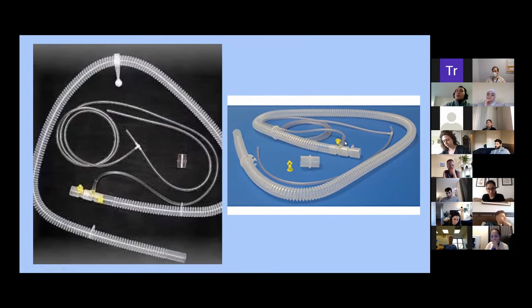The reason it's always open is that the exhalatory port is made there on purpose to provide assistance to the patient in order to always have some leak. I've seen it twice already that they call me for rapids, to see patients that have COPD. They place the patient on BiPAP, and now the patient has a worse mental status since they started the BiPAP, and they're like, what is going on? You go examine the patient and the BiPAP is alarming low leak. The reason is that someone was way too eager beaver and closed this here, and then the patient started re-inhaling their own CO2. So that should never be done.